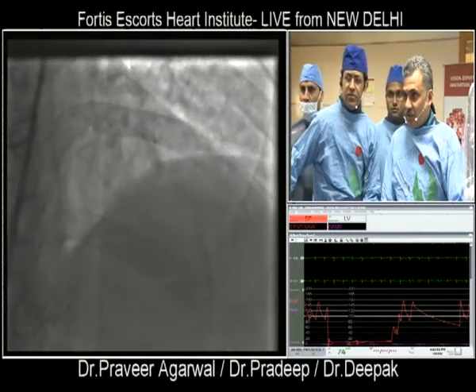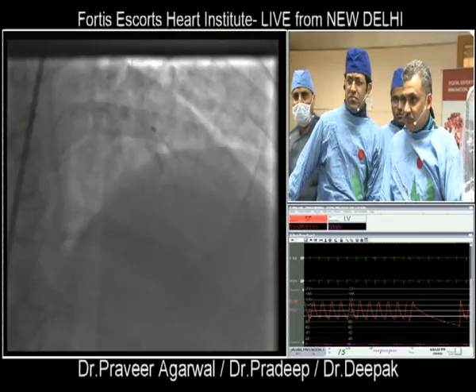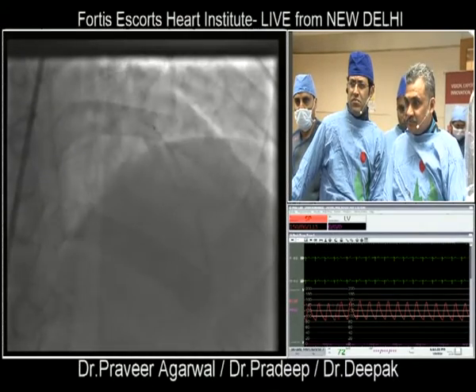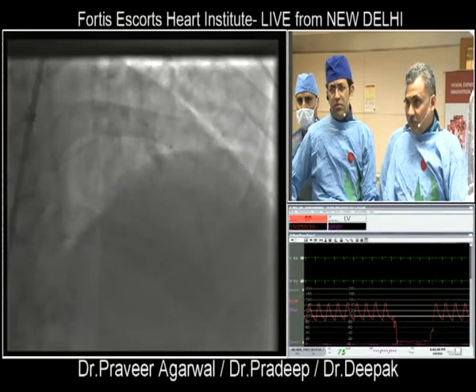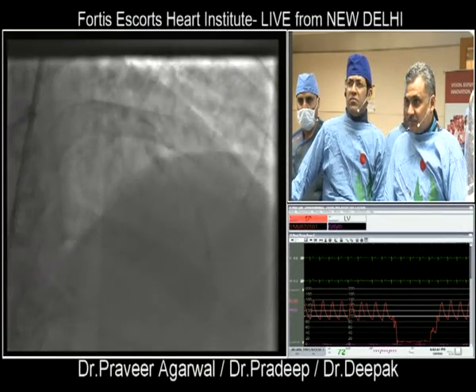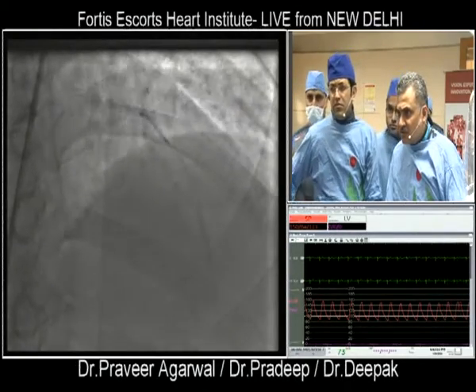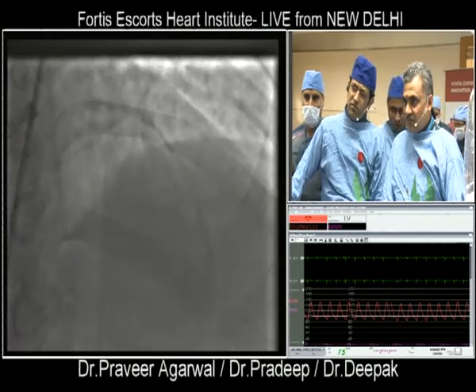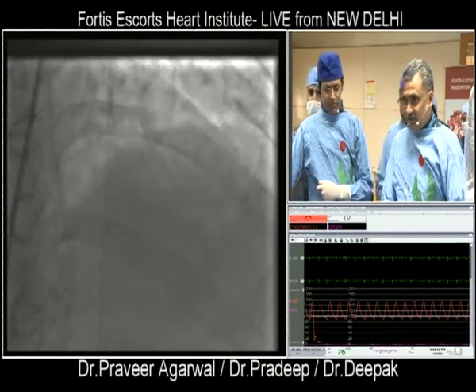Right. Okay. Gently go. 2 millimeter balloon. 1.5, 2, 2.5, 3, 3.5, 4. Deflate. You see the balloon slips down. It's a fibrotic lesion. Okay, go up. 1, 1.5, 2, 2.5, 3, 3.5, 4, 4.5, 5, 5.5, 6, 6.5, 7. Deflate. Let me see how the diagonal is flowing now.